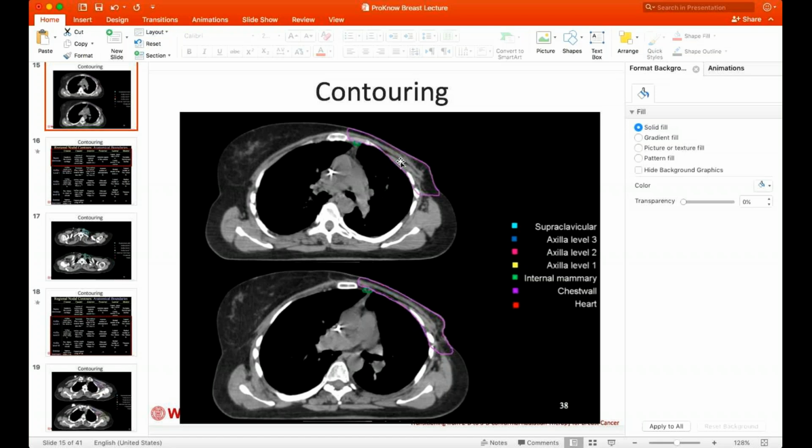So the dose that you would give, whether you hypofractionate, could be the same, but it's still the same principles that apply when it comes to dosing, when it comes to making sure that the PTV of the chest wall is getting a sufficient dose.